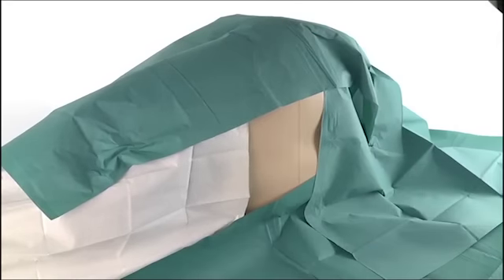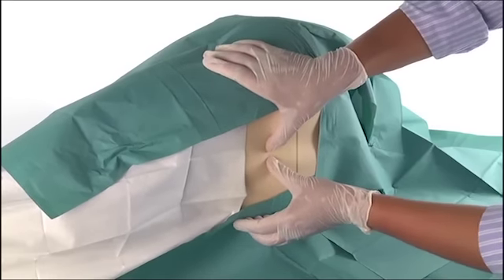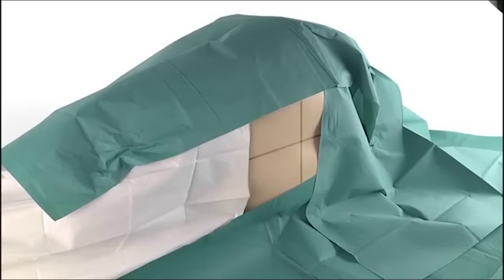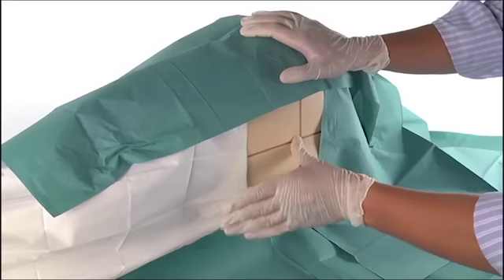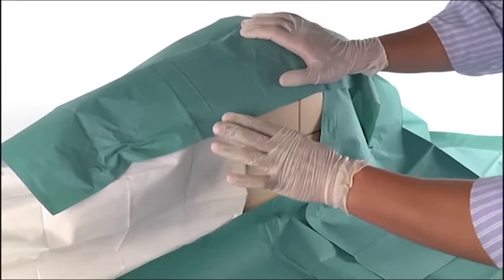superior aspect of the iliac crests. Secondly, find the lateral aspect of the spinous processes. This cross-section of the plane demarcates the L3-L4 position, which can be palpated with the non-dominant hand.